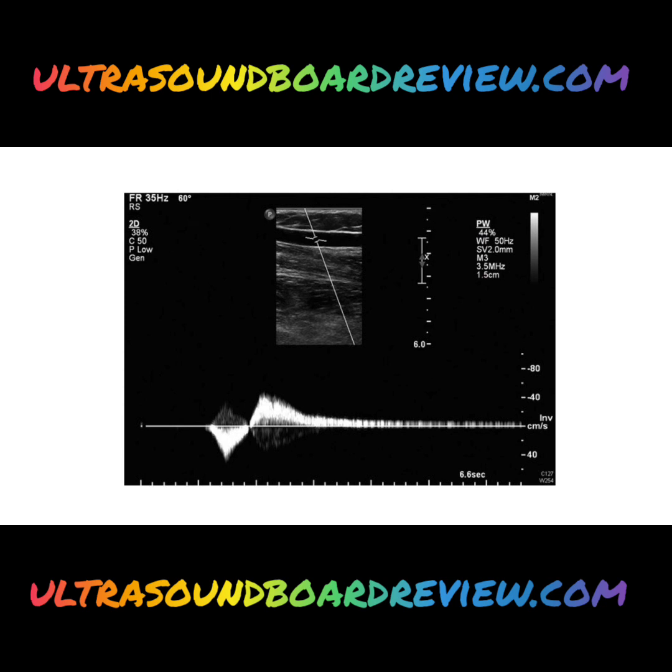So now that we know that positive numbers are towards and negative numbers mean away from our transducer, where's our transducer? We don't have the color box to figure that out. So you have lines this time. What you need to do is draw a line straight down, like so, and then you're going to make the letter H. Here and here. See how we made the H with the spectral gate there? So what you're going to do is find out where those two lines intersect on the top. There's the intersection. That's the side that your probe is on.